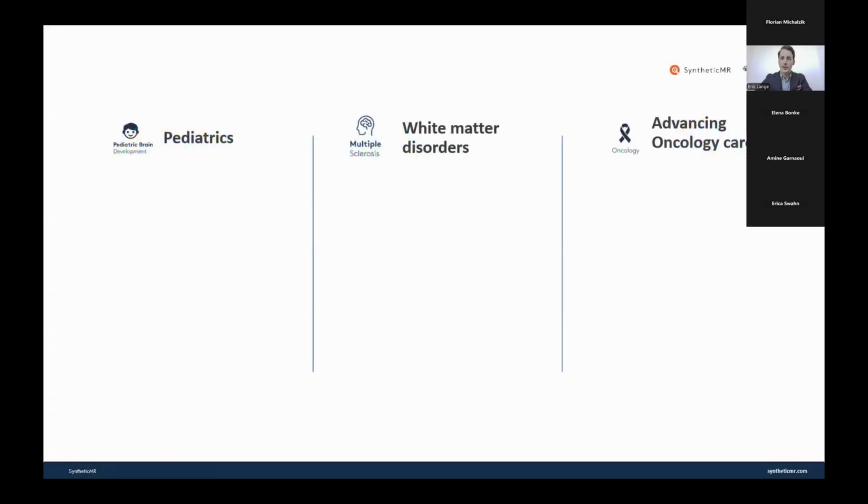So let's now look at 3 different examples of how SyMRI can be implemented into your clinical practice today.